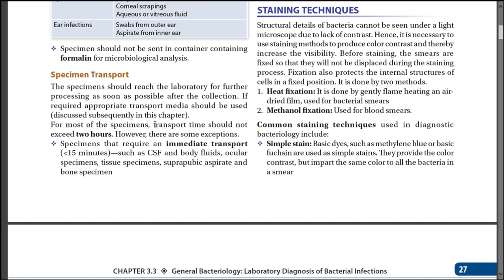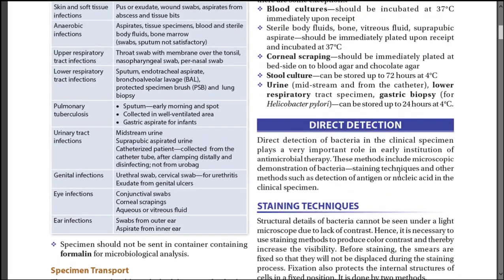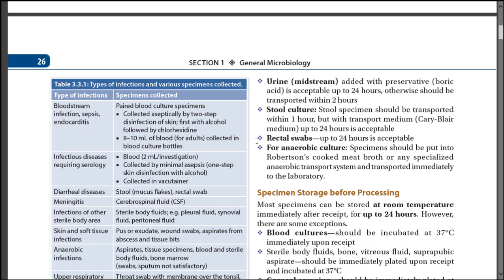But for most of the specimens, the transport time should not exceed 2 hours. If urine is treated with the preservative boric acid, it is acceptable up to 24 hours to check for the presence of bacteria. Otherwise, a normal urine sample must be transported within 2 hours.